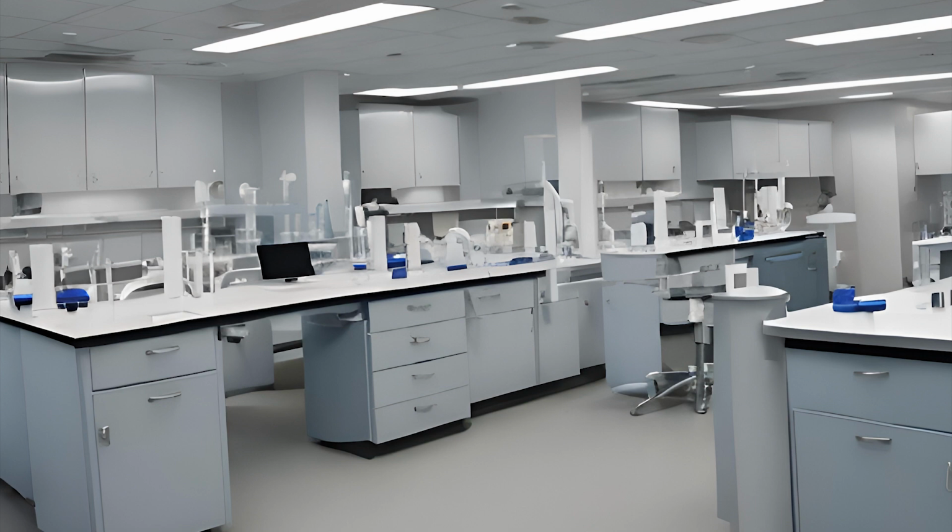Plasma separator tubes or other heparin-containing gel tubes are also available to help maintain specimen stability. Your samples are going to be stable longer sitting on top of thixotropic gel than if the plasma or serum is just sitting on top of exposed red blood cells.